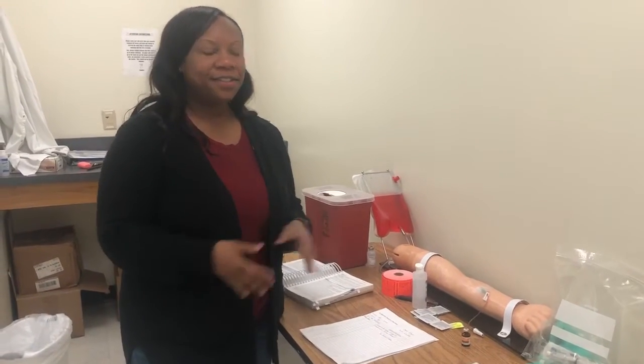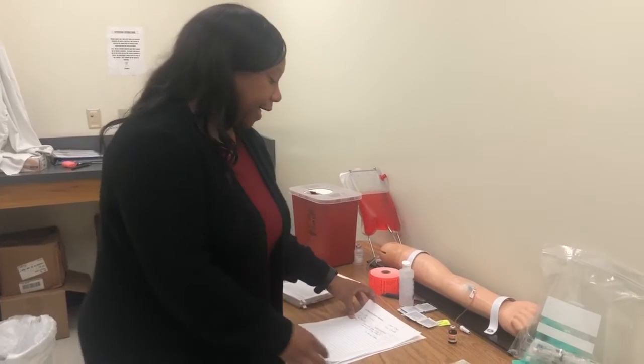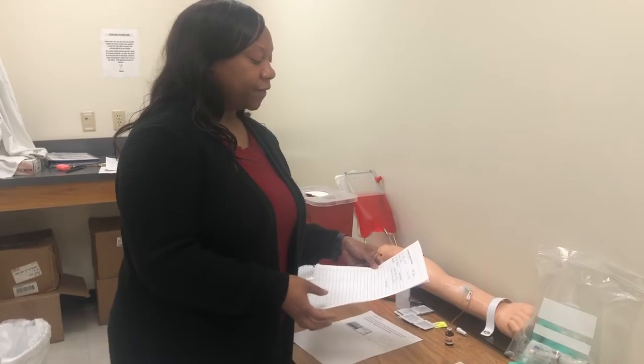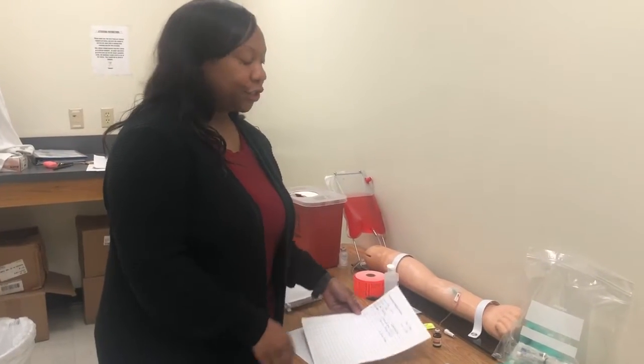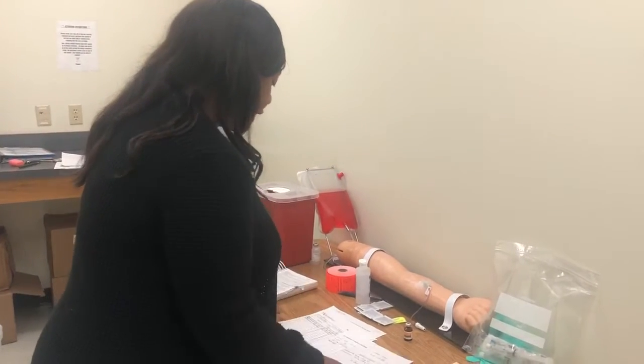Community College student nurse, and today I'll be doing IV push competency. I have a Miss Green for Dr. Moore who ordered furosemide 30 milligrams IV push Q8 hours. So at this time, I'm going to compare my MAR and my order together.